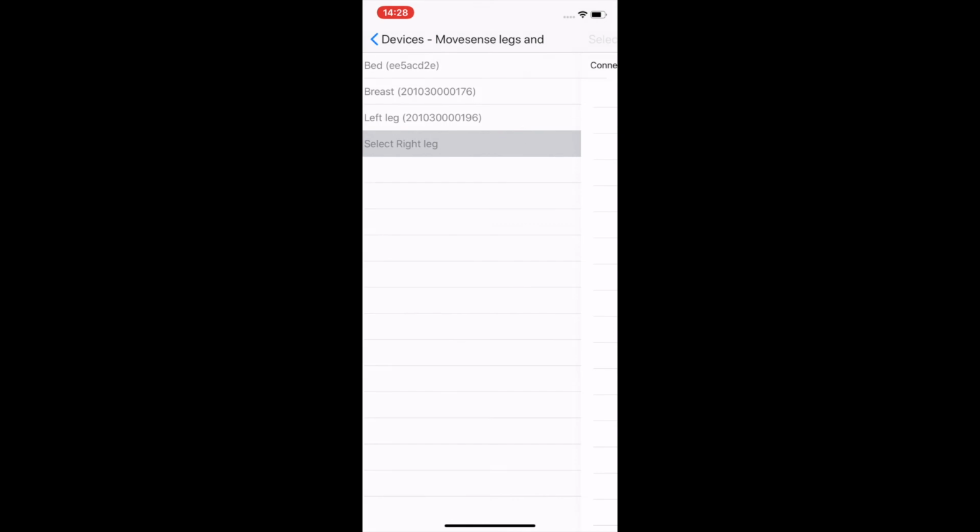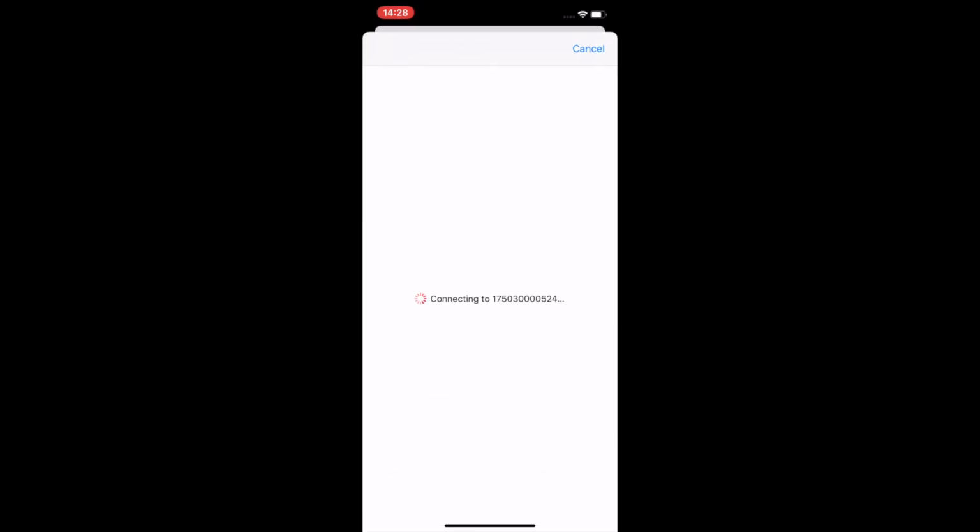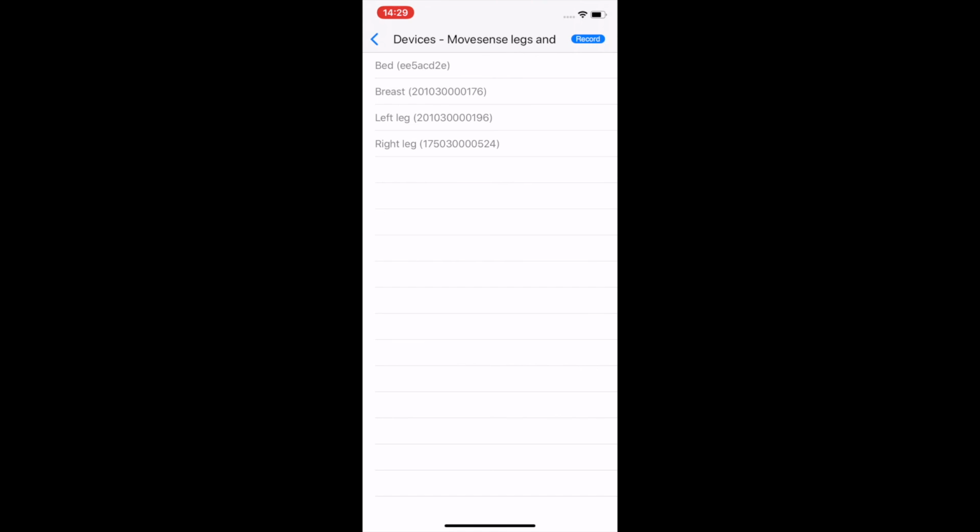We connect it to the device. Here we go, and then we have it added to the system. Here we go, right leg, all chosen. Now we press record. Now all the connections are done and synchronized, and here we go, and the connection is on.